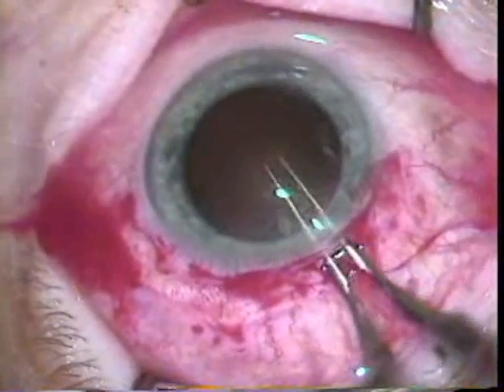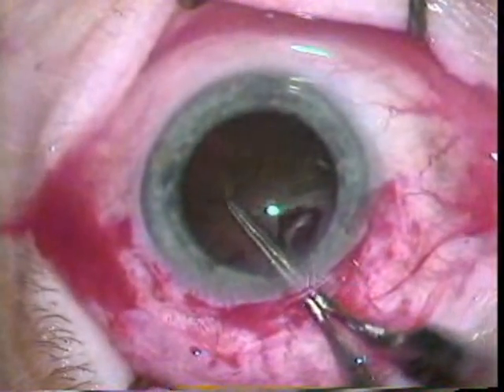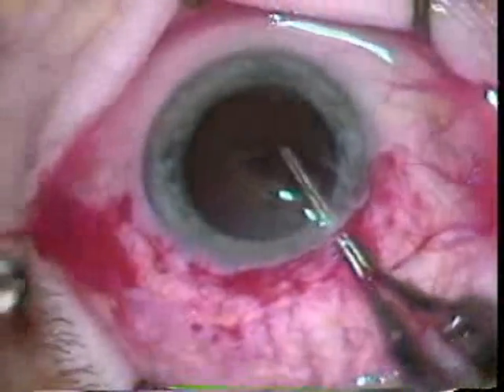Now with Kelman forceps, he's grabbing the capsule and pulling it free, pulling it out with all the perforations that were made with the can opener.